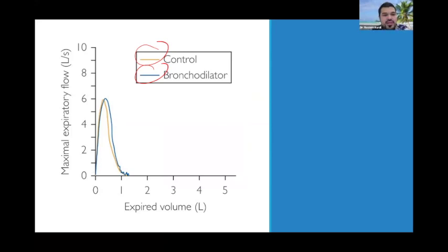He appears to have done okay in terms of his peak expiratory flow. The shape per se is on the small side, but the pattern looks normal. There's no obstruction, because when you have an obstruction like that patient, you'll see the flow slows down, like we just saw. That will be an obstructive pattern because the flow rate keeps going down. You're trying to empty out your lungs, but you cannot because something is blocking the way, so it's taking you longer and slower to empty your lungs. But here, it looks like there's nothing really obstructing your lungs. You're able to empty quickly and empty all your lungs. I just didn't have a lot to give.